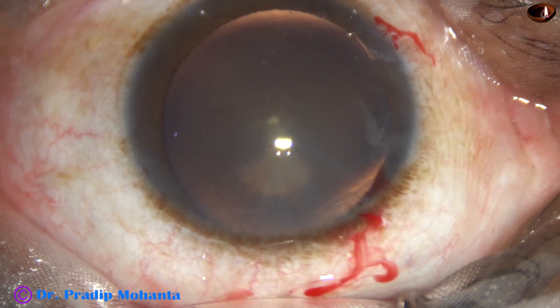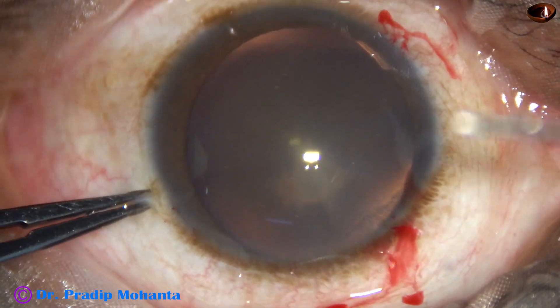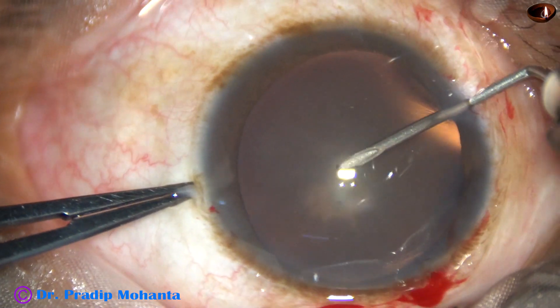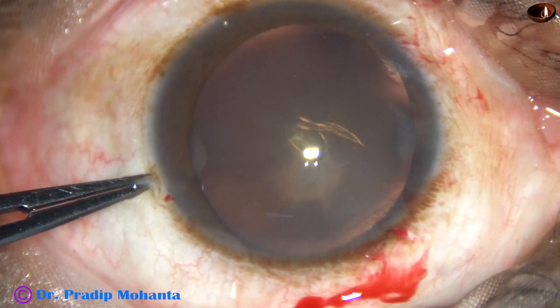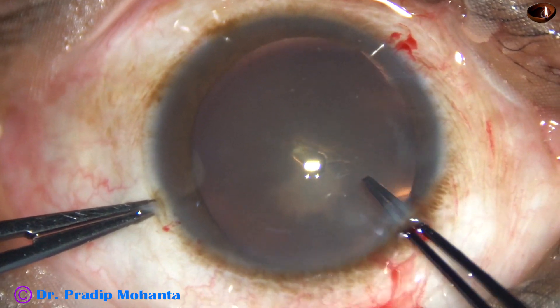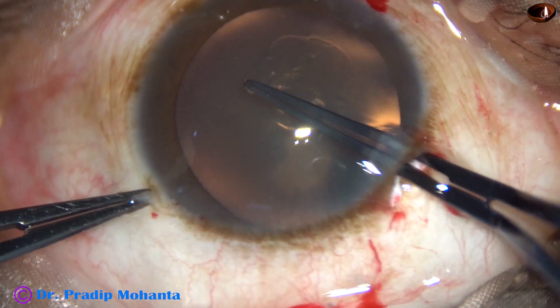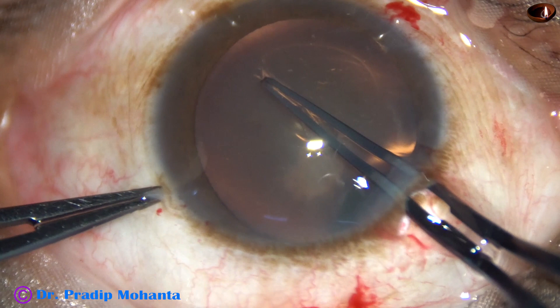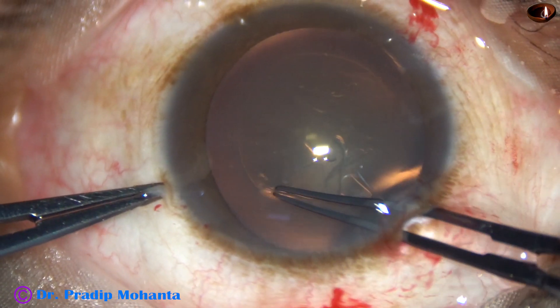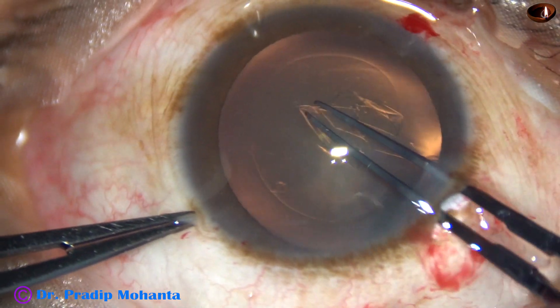And now, capsulorhexis. A capsular tag is being raised with the help of a 26-gauge bent needle. Now I hold this capsular tag with utrata forceps, go anticlockwise, and do a round rhexis. The size of this rhexis is about 5 mm or 5.25 mm.